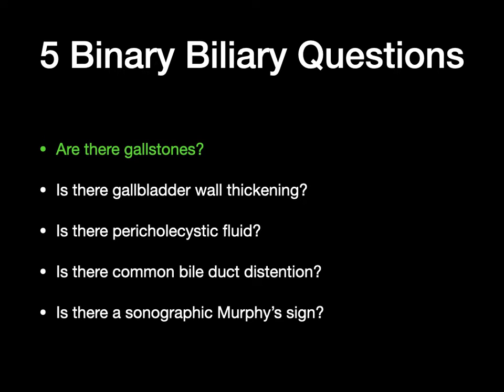So let's move on to our 5 binary biliary questions. These are really the point of care questions that we ask when we put the probe on the patient for this purpose.